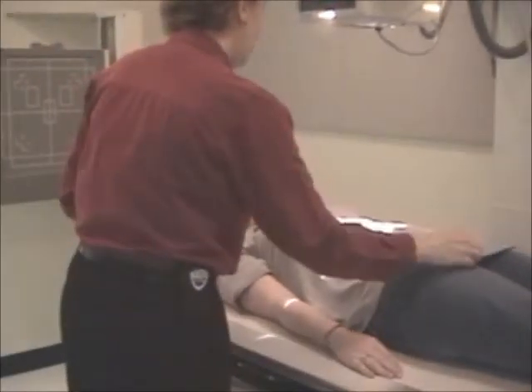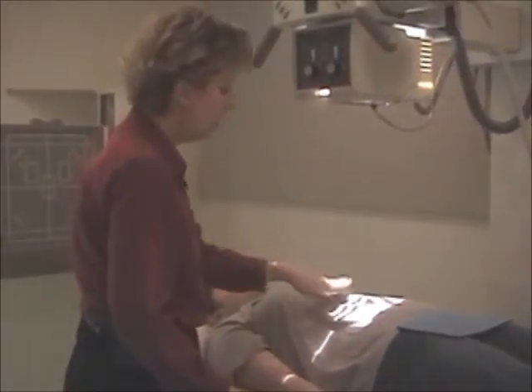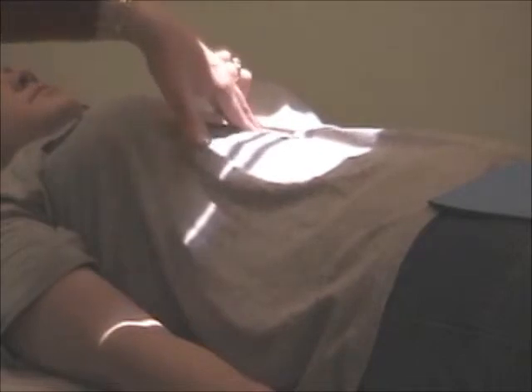And now the reference part for a sthenic patient. Again, the stomach is fairly midline, slightly to the left side. I'm going to use her xiphoid process, and I'm going to be 1 inch inferior to that, 1 inch below, and I'm going to be 1 inch to the left, because the stomach is slightly off to the left side. I'm going to look over my patient and make sure I'm not x-raying tabletop. And I'm not x-raying tabletop, so I'm happy with that position.